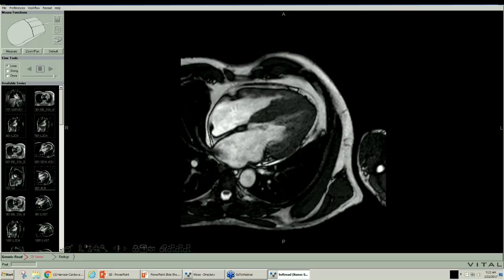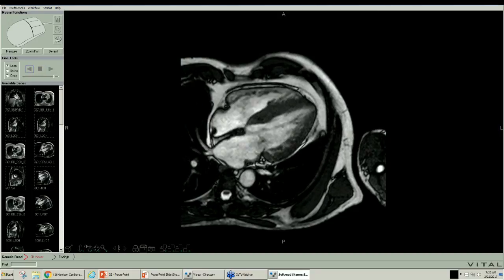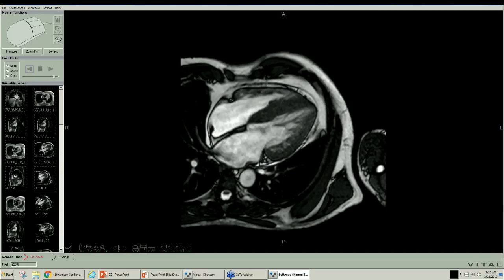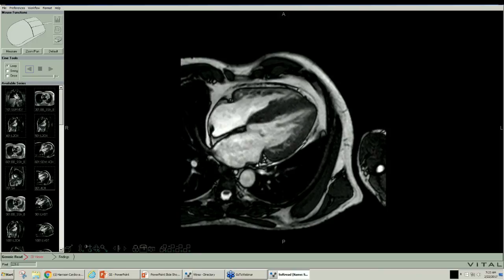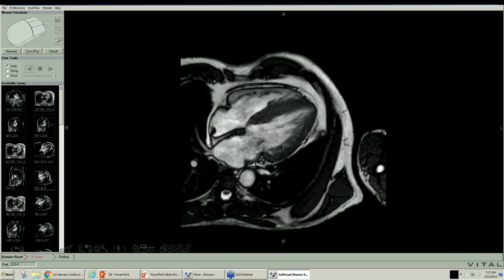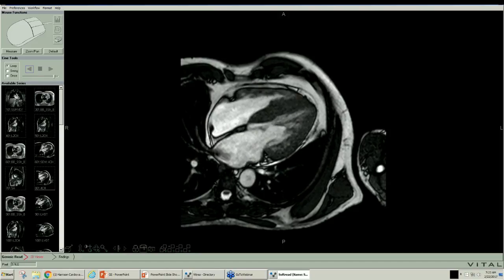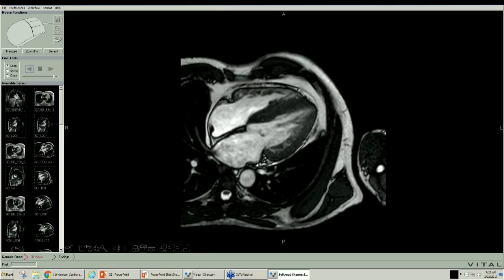There's another four-chamber view, more of a pure four-chamber view. And this is really pretty. We line up the tricuspid valve, the mitral valve, slight left atrial enlargement, little puff of mitral regurgitation, and we can actually measure the amount of mitral regurgitation by calculating the ejection fraction and the stroke volume of the right ventricle and that of the left ventricle and subtracting them and seeing what the difference is. So we've got like four ways to calculate the amount of mitral regurgitation. Pericardial sac looks nice. I don't see any abnormalities of that.